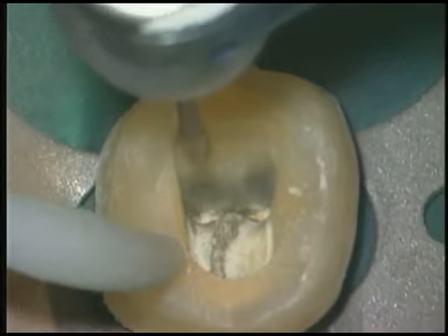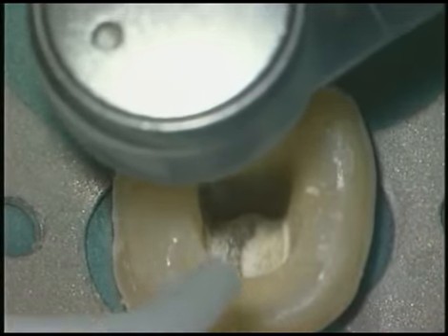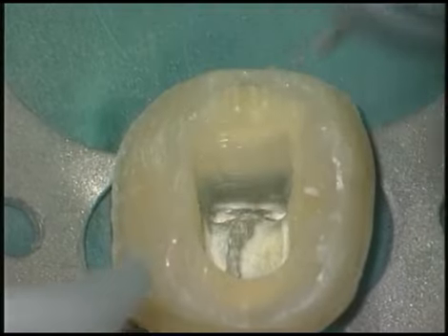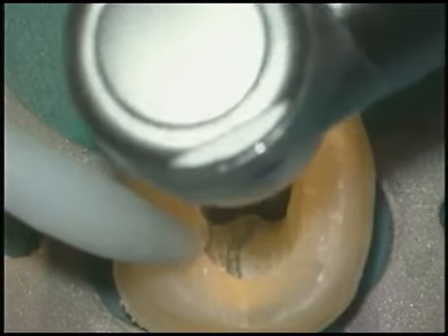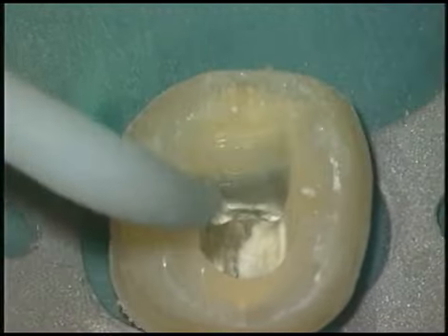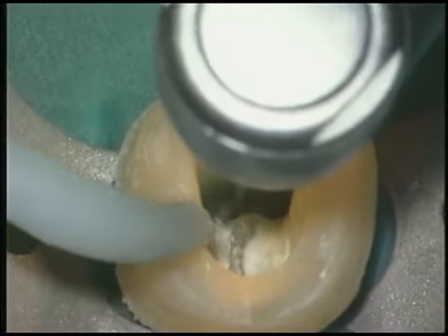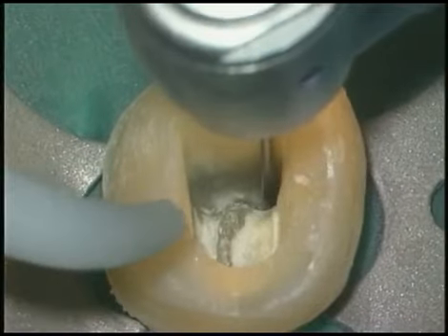That allows us then to bring in tapered diamonds, and we can flare back the mesial axial wall. This will improve our access into the middle 1/3 of the root. Smaller GGs then are used in a crown-down manner. These GGs are tapped very lightly into the canal. I want to emphasize the light pressure that we use the Gates-Gliddens with. It would be analogous to writing with a pencil without breaking the lead.